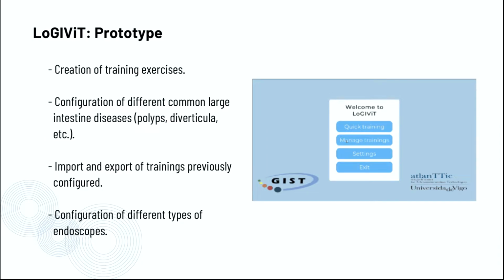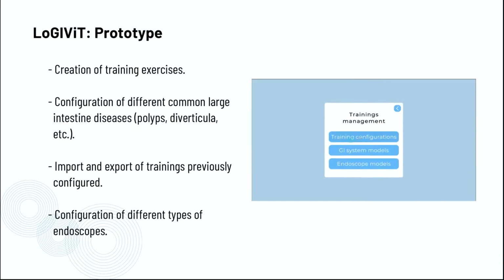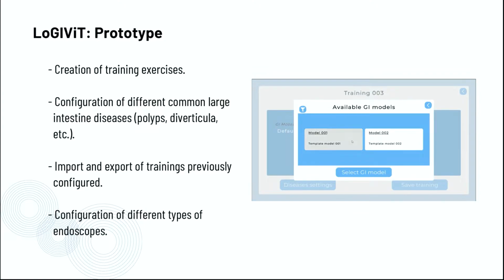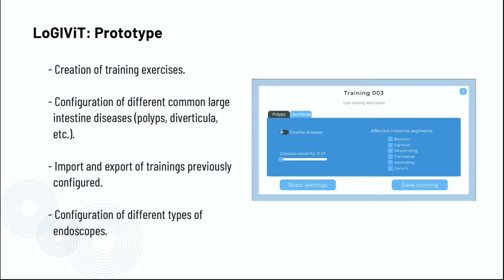This leads to our current prototype, where the main issue of creating procedural models and allowing the creation of training scenarios was assessed. Such training configurations allow defining diseases, their severity, and the affected segments along the intestine and endoscope model to use, while being exchangeable between users.